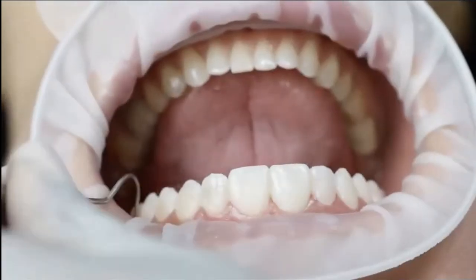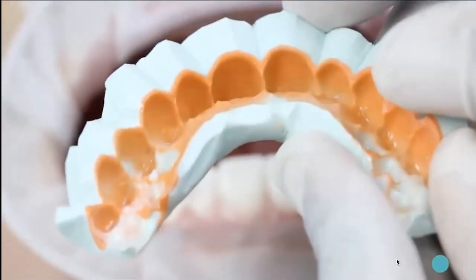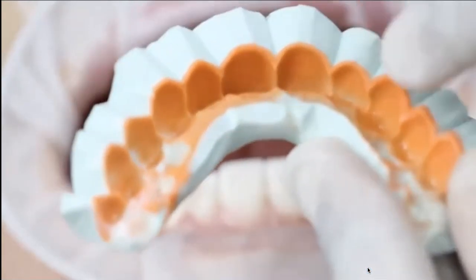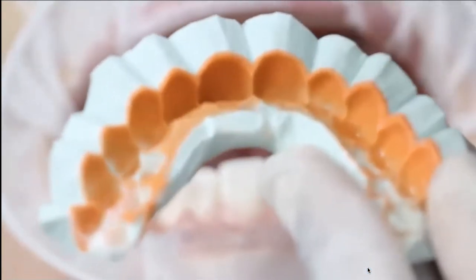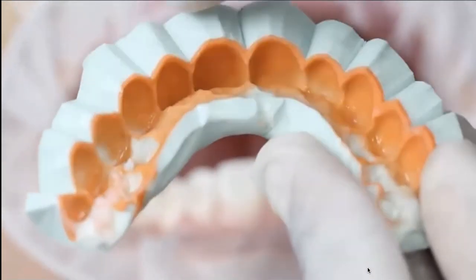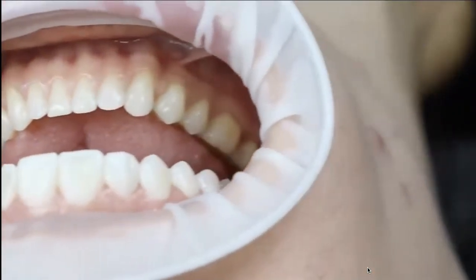Then use a soft flex if needed to check on occlusion, to check on guidances. That's just a little explanation showing you how I did the silicone key. As you can see in orange, I have the light body and then I have the heavy body as well. The reason why is because I wanted to copy as much as possible the morphology of the tooth so the patient could have the best experience.